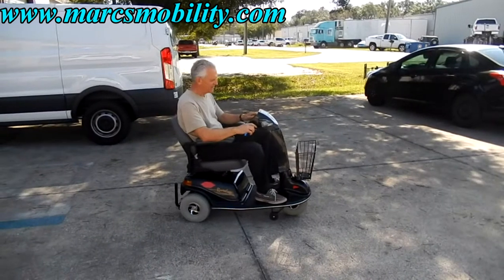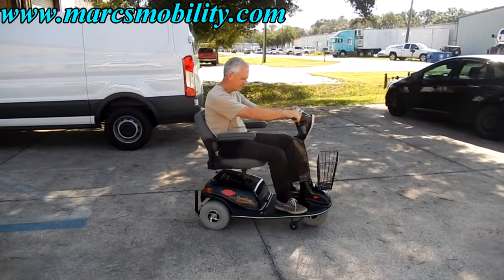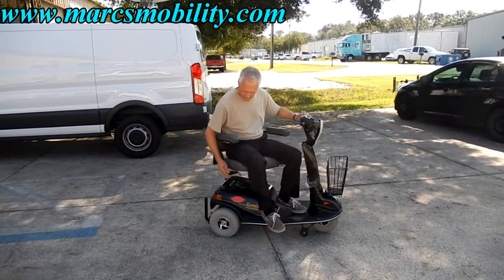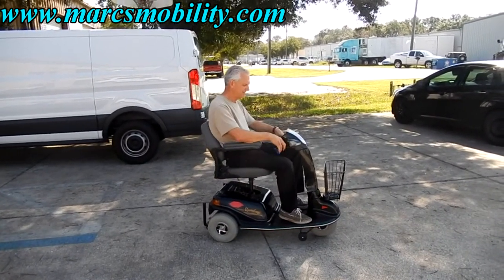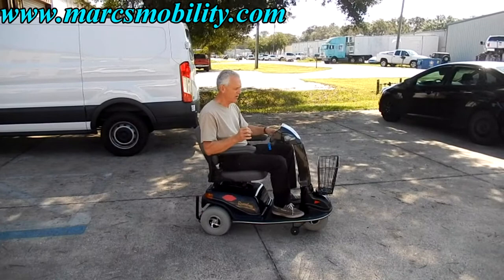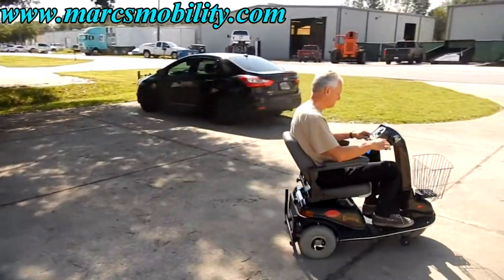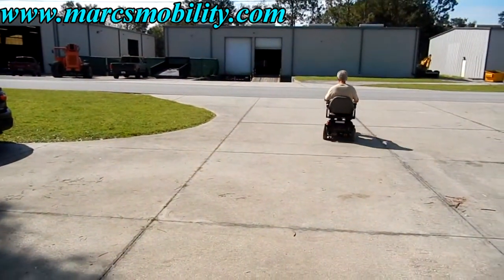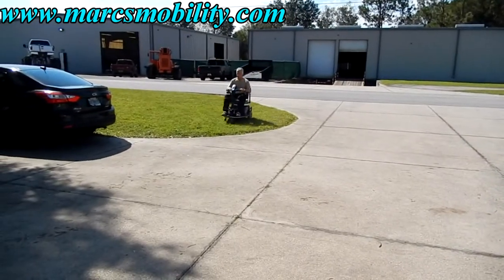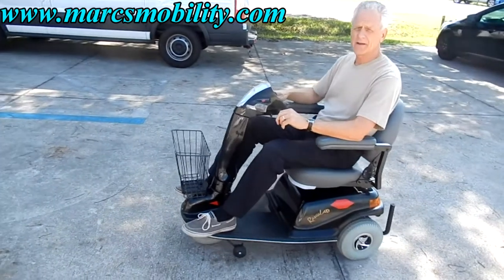A lot of speed and power on this scooter. If I put the seat lift forward, you can see my seat going up. I can still swivel my seat when elevated. Always drive with the seat down when you're outside — don't drive with the seat elevated, you're asking for trouble. Great suspension and a great riding scooter.